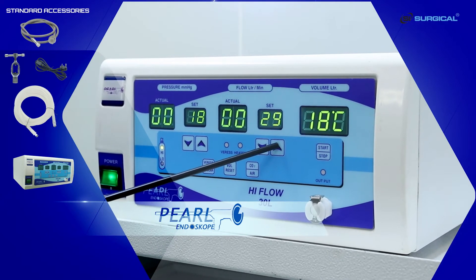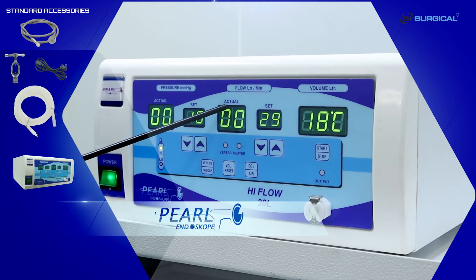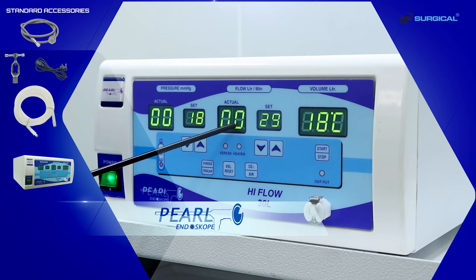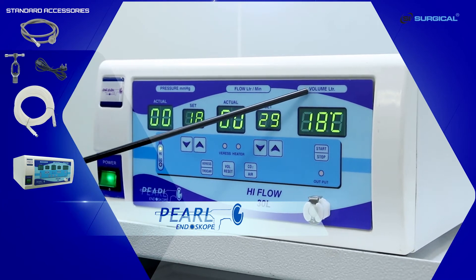On activating the machine, this display shows the actual flow rate. This display shows the volume of the total gas being used and temperature.